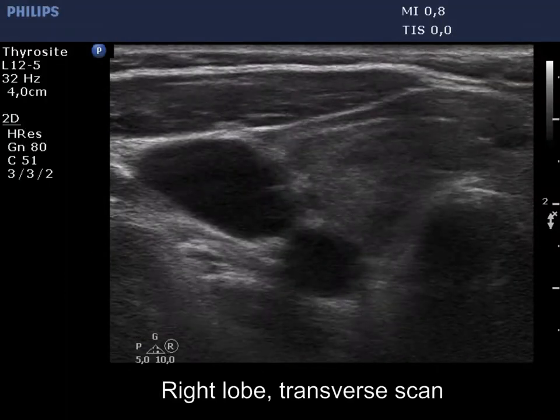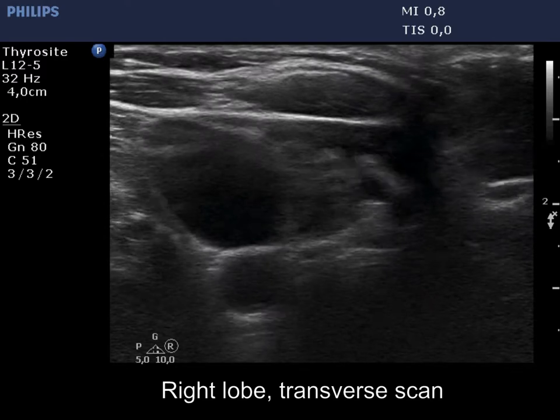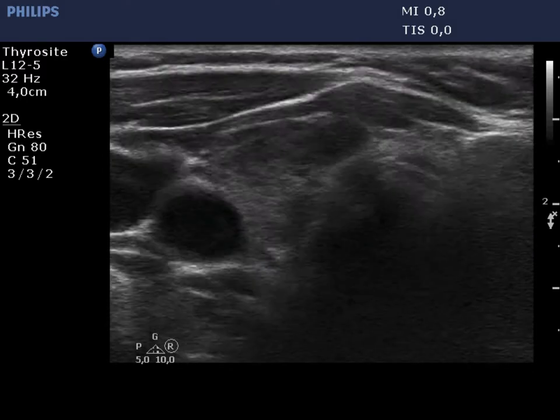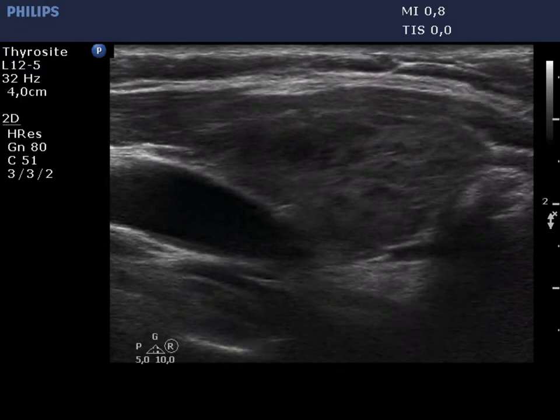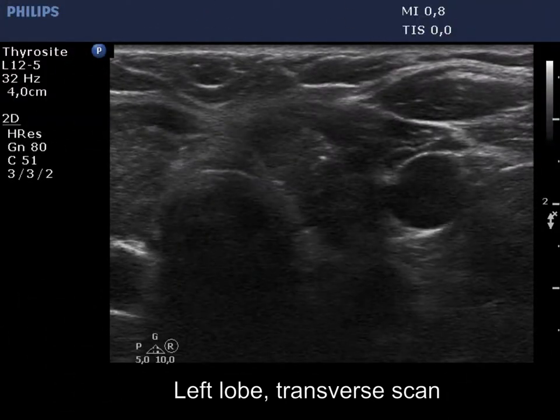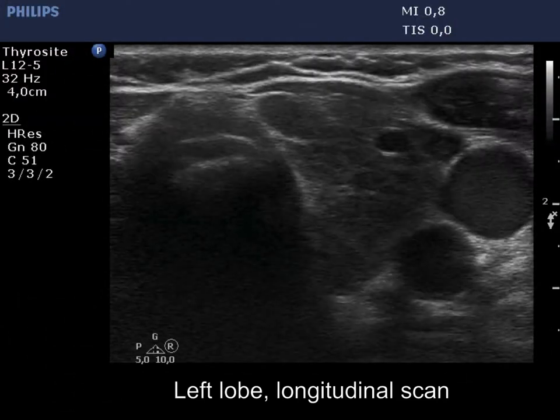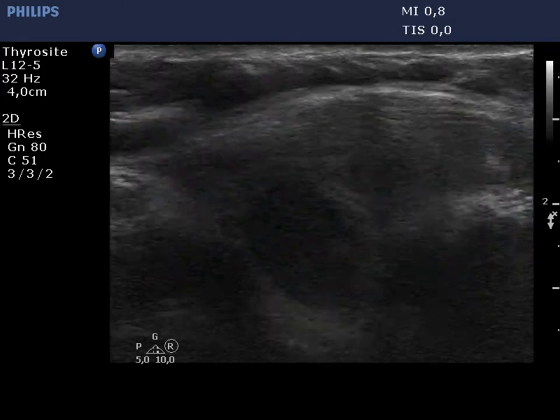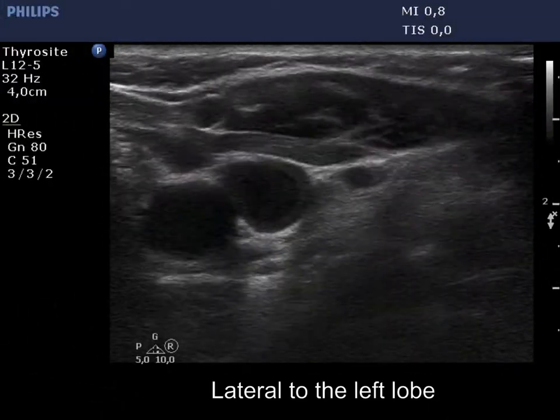The thyroid is minimally hypoechoic and presents numerous, more hypoechoic, tiny discrete areas. None of them corresponds to a pathological nodule. The left lobe has a similar appearance. This is one of the most common ultrasound patterns of autoimmune thyroiditis.